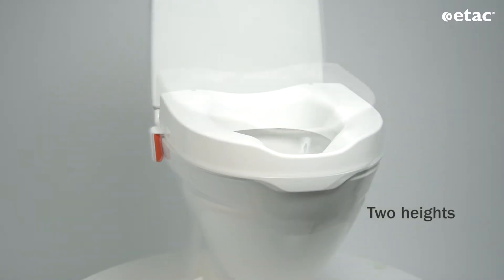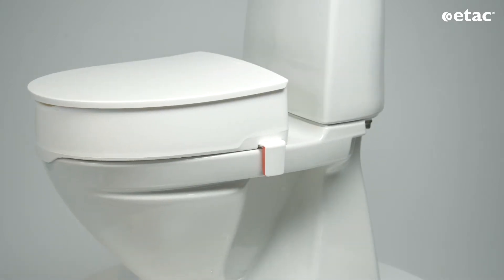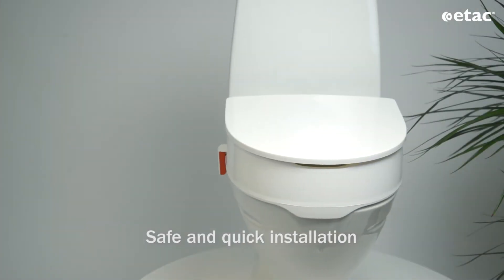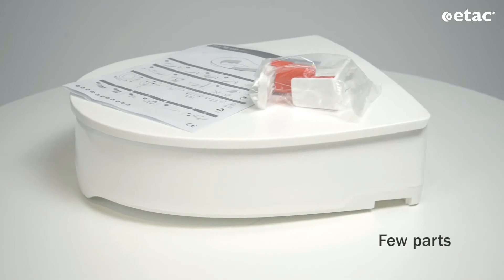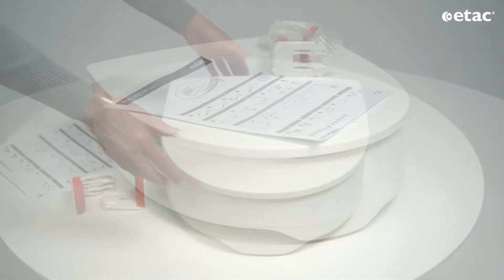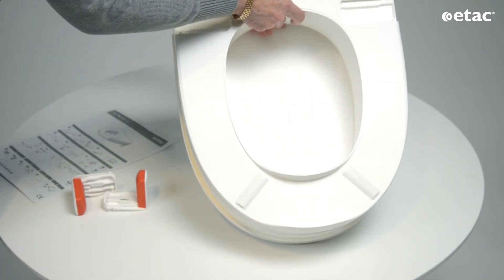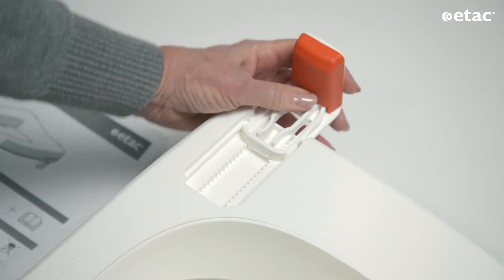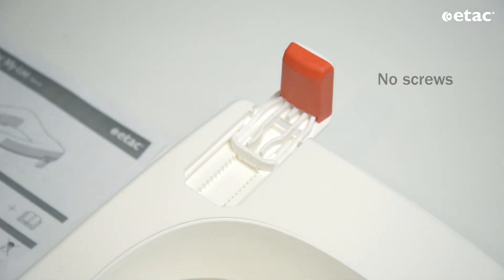The seat has two height options, with or without lid. ETAC MyLoo is very easy to install. The seat raiser consists of only a few parts. Start by putting the brackets in place. Their special design with no screws makes the installation quick and easy.